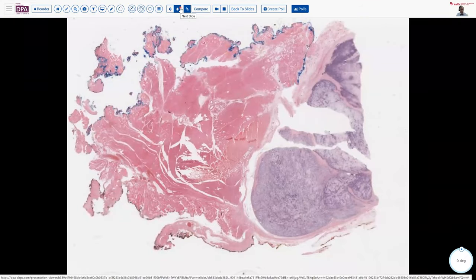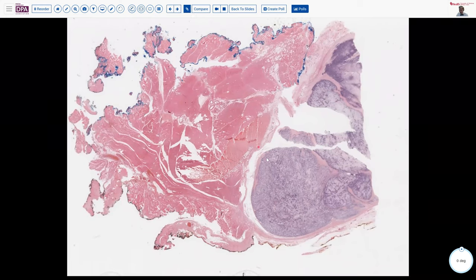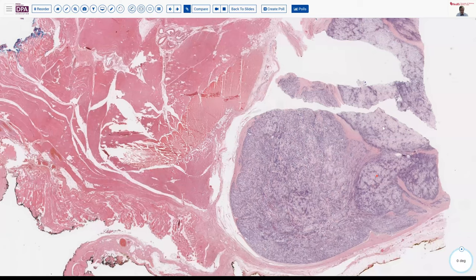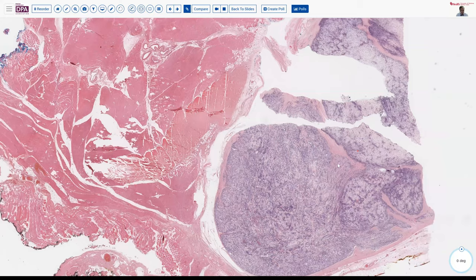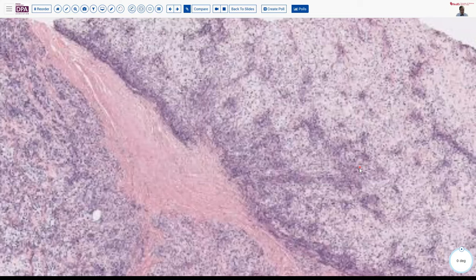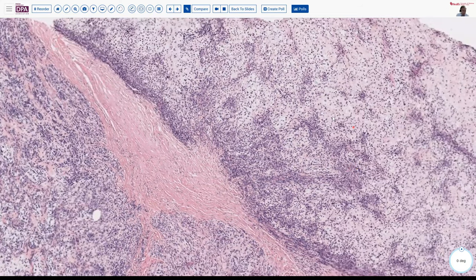This is a soft tissue mass, which also involved bone, located in the pelvis. And the patient is an adult, an older adult. And this lesion also has a cartilaginous relationship. So we see sort of this bimorphic or dimorphic pattern with some paler areas and some more blue cell type areas. We'll focus here first on these paler areas, and you'll begin to recognize that this fits with our theme that we're taking today.